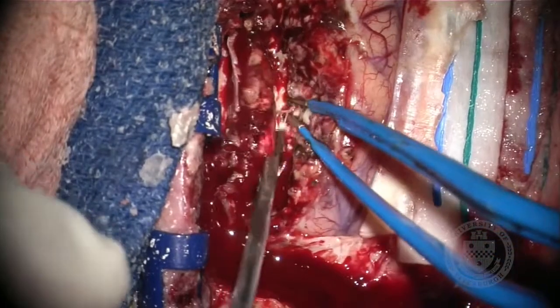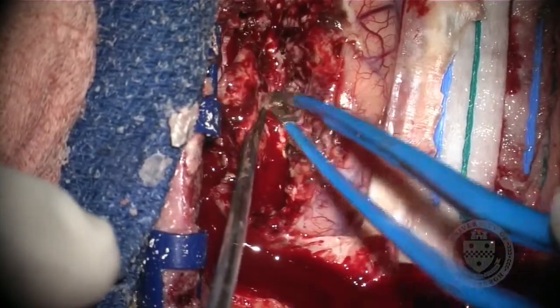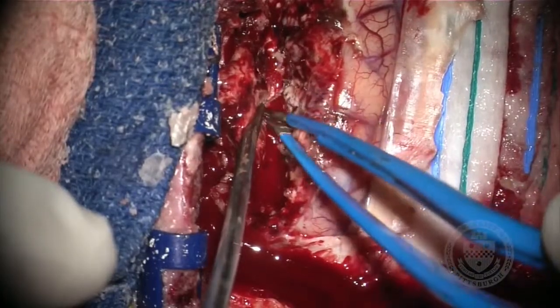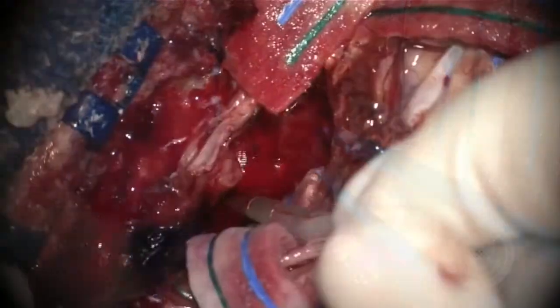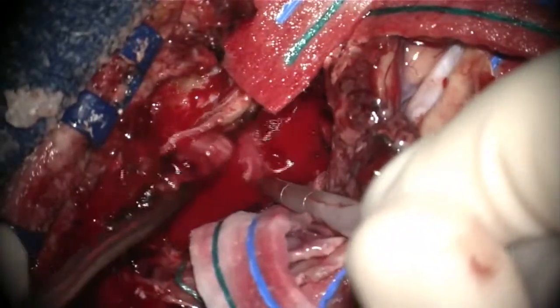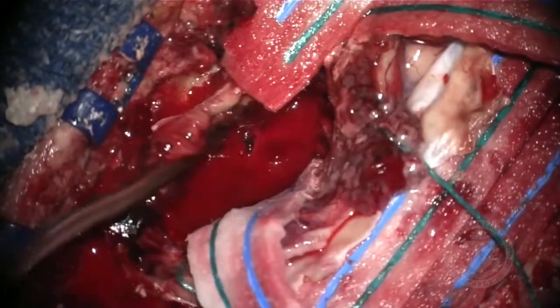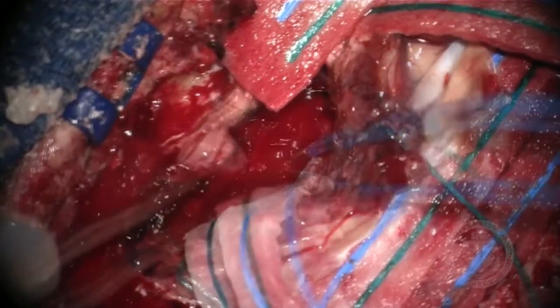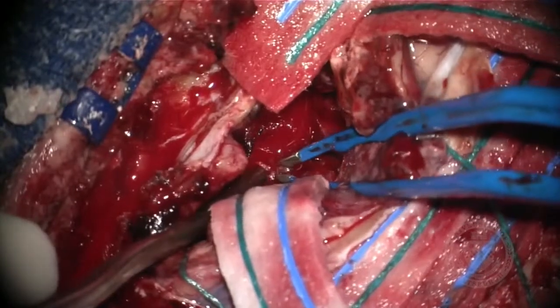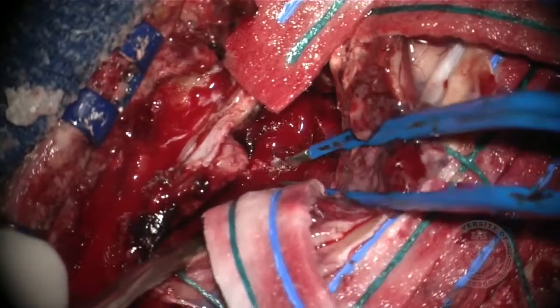We have performed a posterior temporal craniotomy and an approach to the posterior aspect of the inferior temporal sulcus. We work our way into the tumor and we observe that this is a very vascularized tumor. We use the bipolar to coagulate the surface of the tumor.